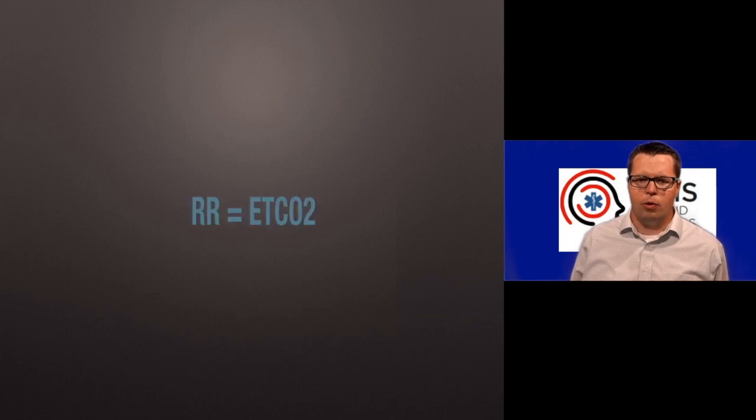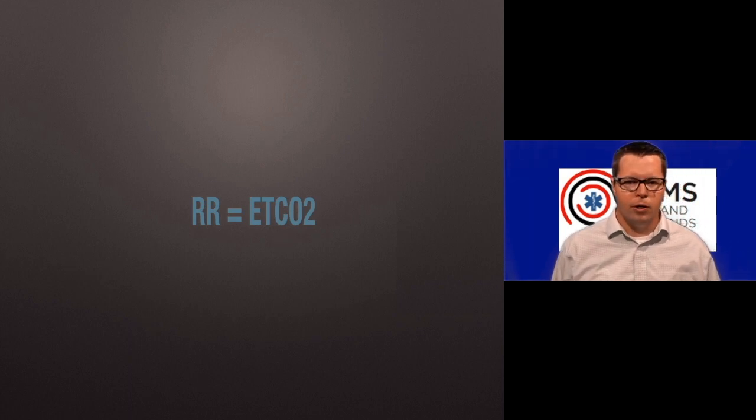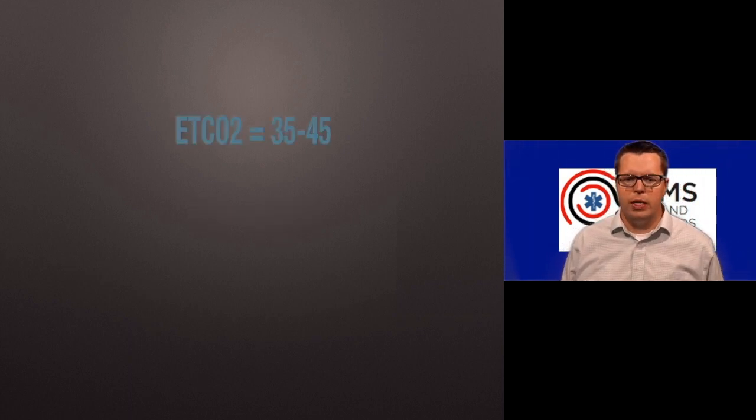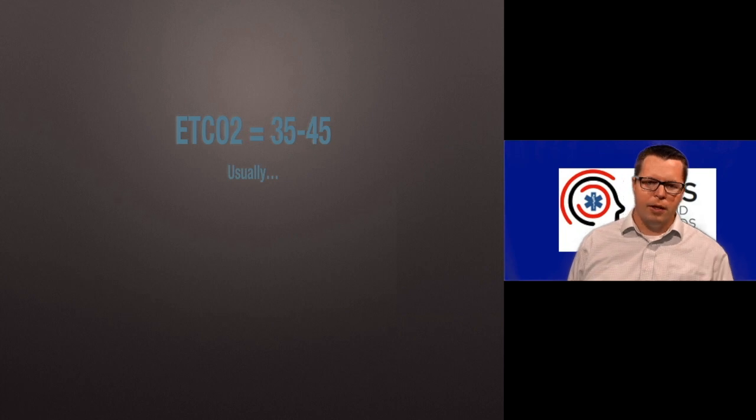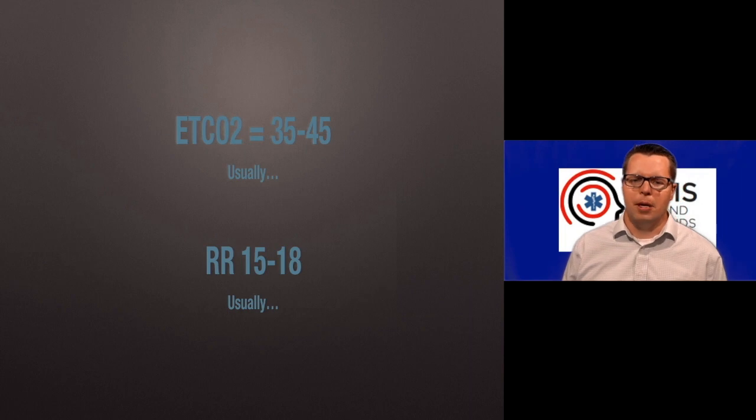That's tidal volume. How about the rate of ventilation? Rate's one of the other things we're going to set. If you remember, respiratory rate basically determines your end tidal CO2. If you have a fixed tidal volume, which we're going to try to fix, how fast should we be squeezing this person? Well, we want to get their end tidal CO2 ideally between 35 and 45, which with a reasonable tidal volume is going to be somewhere around a respiratory rate of 15 to 18 in most intubated patients.